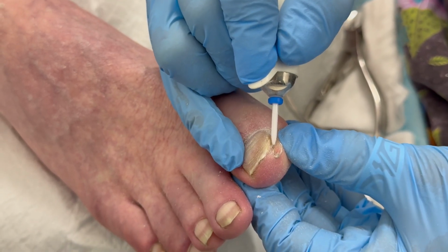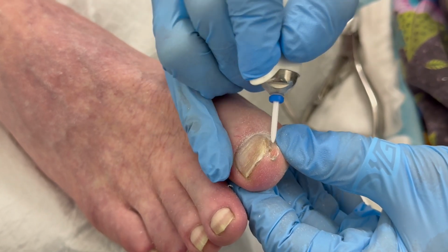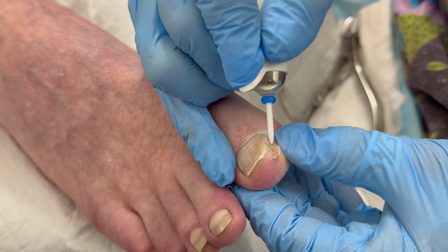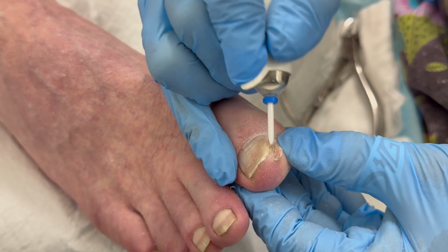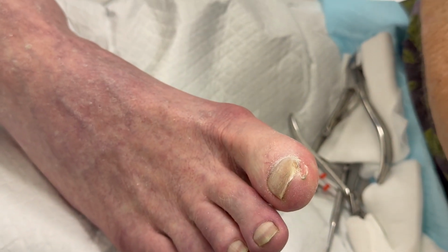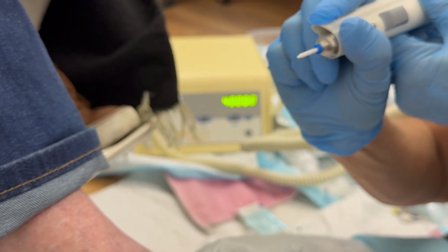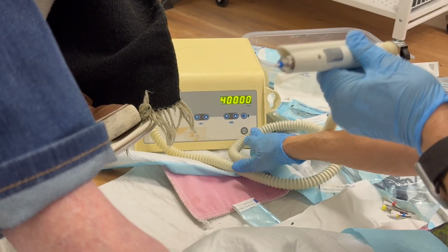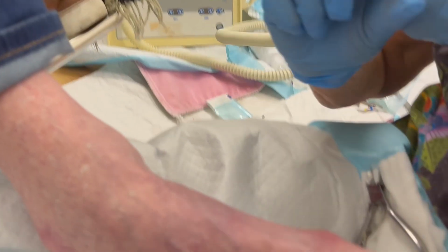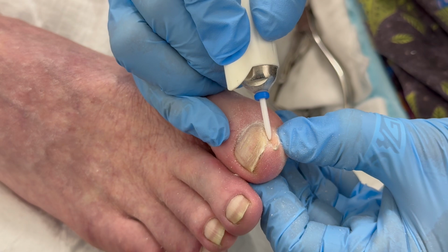So I'm using the moderate pointy. Really have to be careful in there. Now I'm going to do it the other way, the forward. Okay, so we now know green light is reverse, no green light forward. Somehow it stopped there. Okay, here we go. So now we're going to go forward again because I'm going to get into this crevice down here.